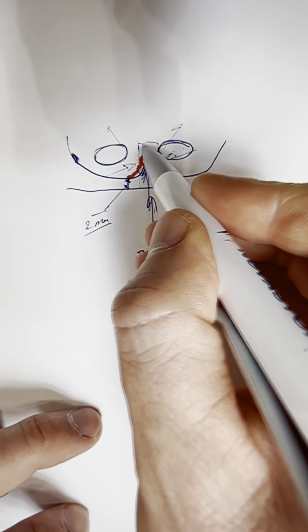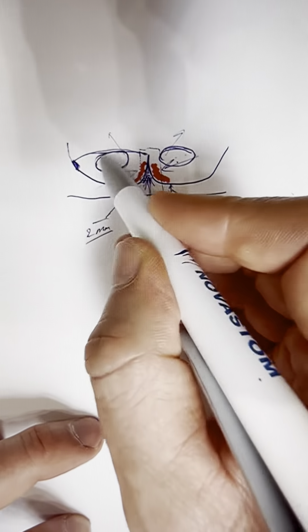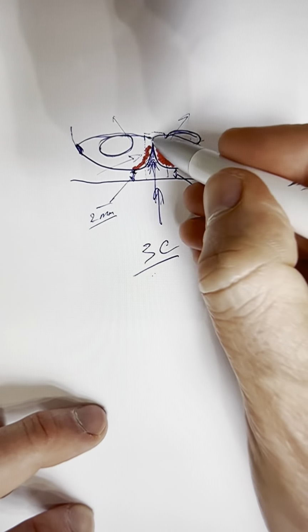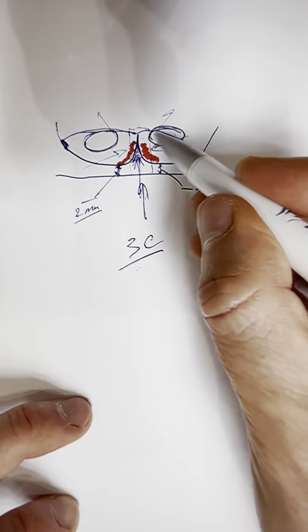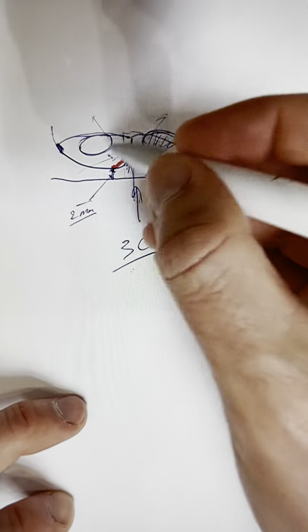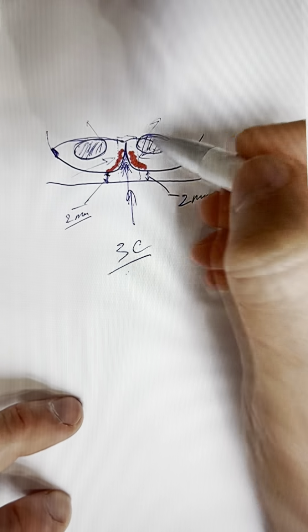Why the distal side? Because it might seem that you can do it like this, but you still have to go to the distal side, and you should elevate the Schneiderian membrane in this area so that the implant does not damage the membrane during insertion. That's why here, since there are 2 lateral windows, we'll enter through them. There are no other options here.